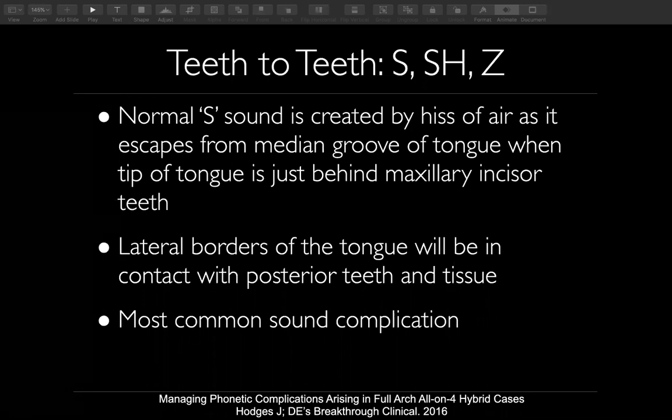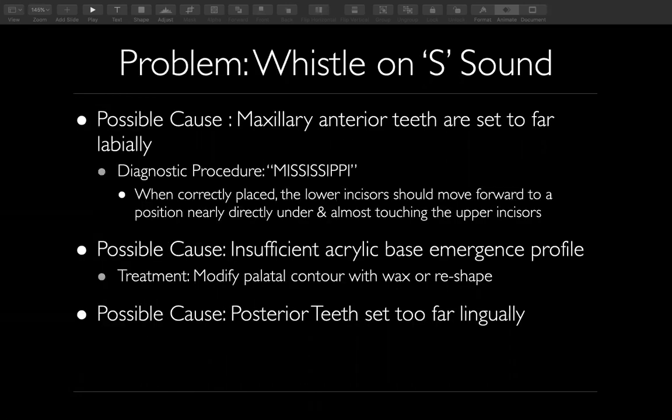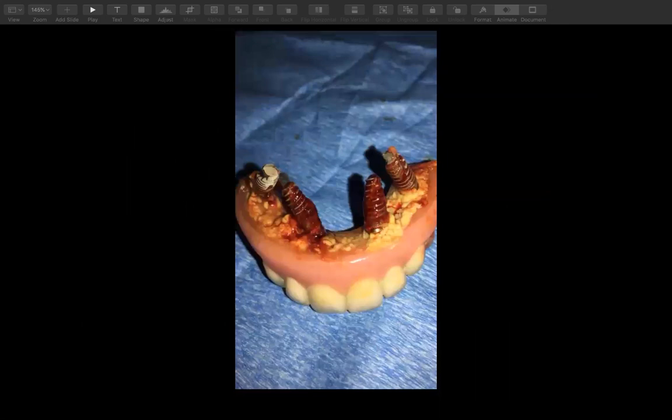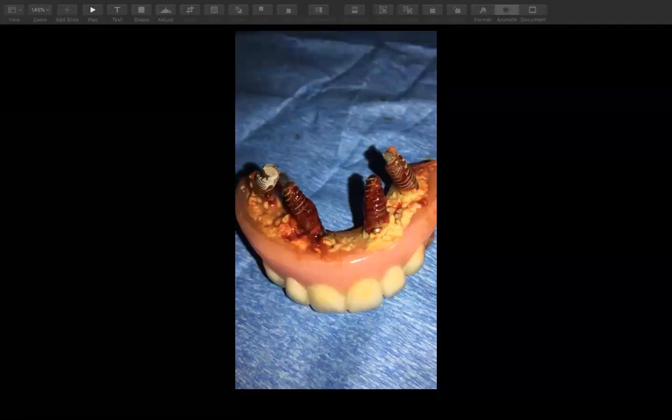And like I said, you'll have access to this. I can send it to you so you can read it at your own leisure and have it as a reference. But these are just some of the different things you could possibly do to help them form their words properly with their phonetics. Again, this is why we don't want to have concavities. You can't get in there and clean it. Everything failed.